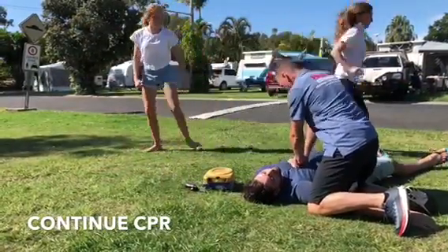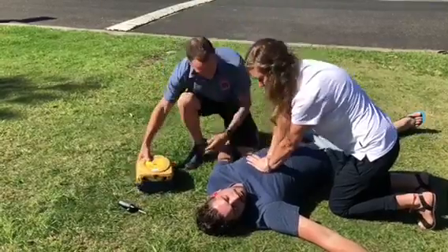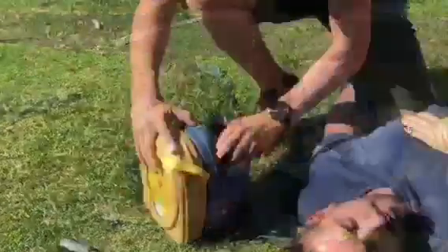In this scenario, we're doing compressions only CPR, directly on the centre of the sternum, roughly between the nipples, at a rate of 100 to 120 a minute. It's important that we continue CPR while the defibrillator is being applied to the patient's chest.